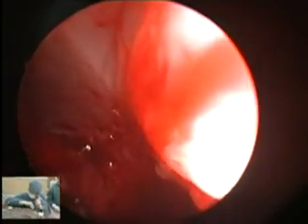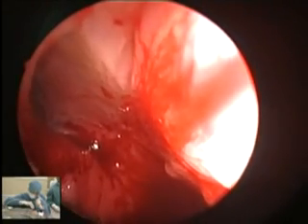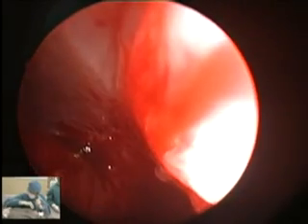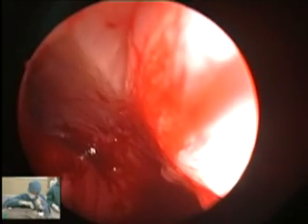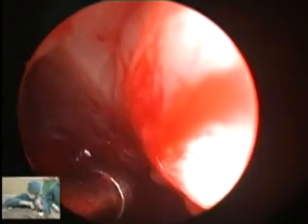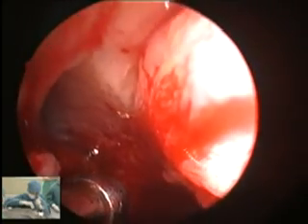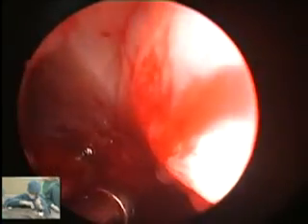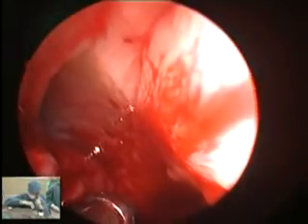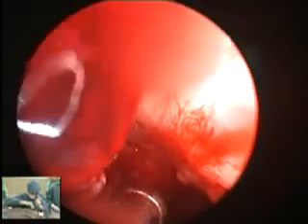Well, the opening is there, but it's receded. It's quite lateral. Okay, so probably I would not enlarge this opening. I think the size is quite all right. The problem is the lateral situation. If I do too much manipulation around here, I will end up with scarring, fibrosis, and the result may not be good. So I would certainly adopt other approaches now and see if I can remove the rest of the fungal content inside the maxillary sinus, but leave this passage relatively intact.